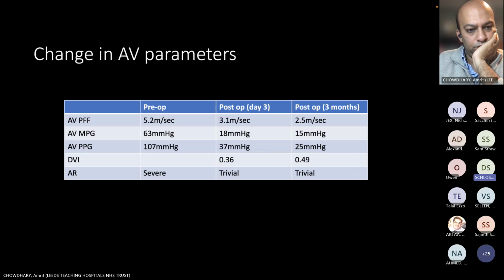As I said, the caveat is it has to be done properly, because otherwise it's like any investigation. If it's not done properly, it potentially can be harmful because it sends you down the wrong path. So I think it was important. It's quick and easy and accessible. That's why, as TOE is an invasive test, and this guy was intermittently going into pulmonary edema.